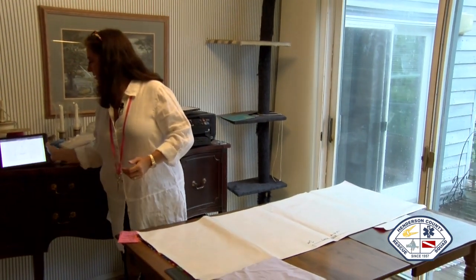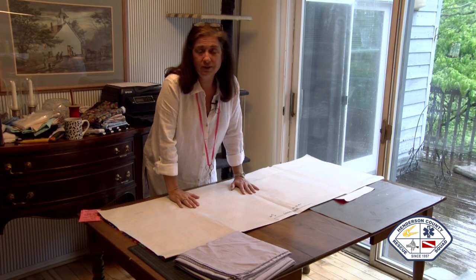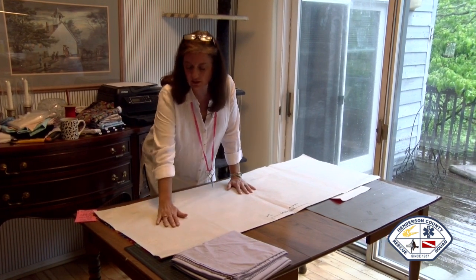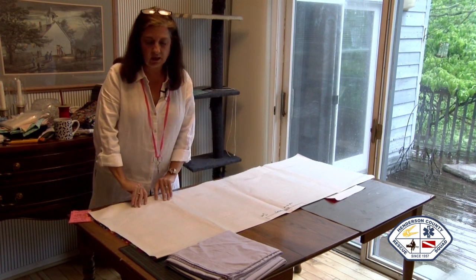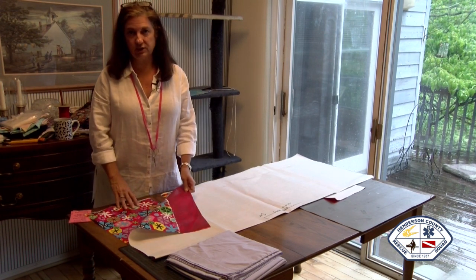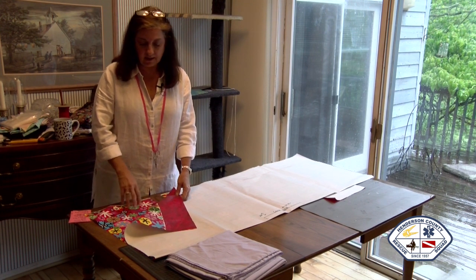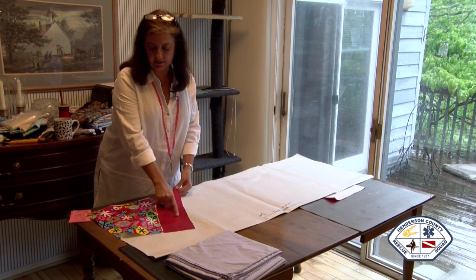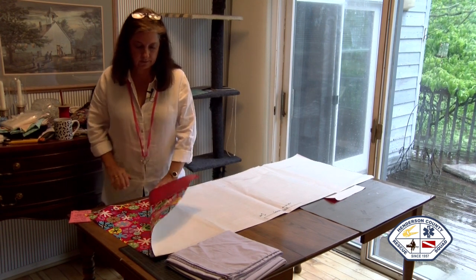I'll make it a little bit easier. So we're going to start with Christmas wrapping paper. And it works great. This particular kind has inches marked off on it. It works super, super great. We're going to need 44 inches wide and 57 inches long. My paper is only 40, so I had to splice a little bit. To show you how I did it, I used two different papers.